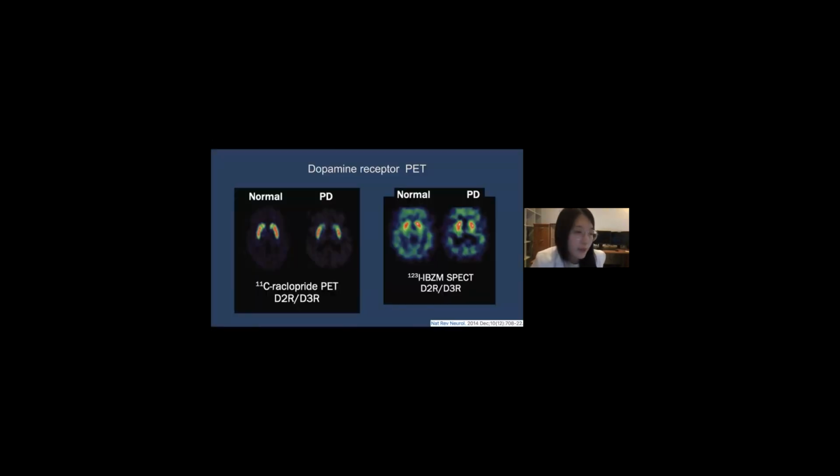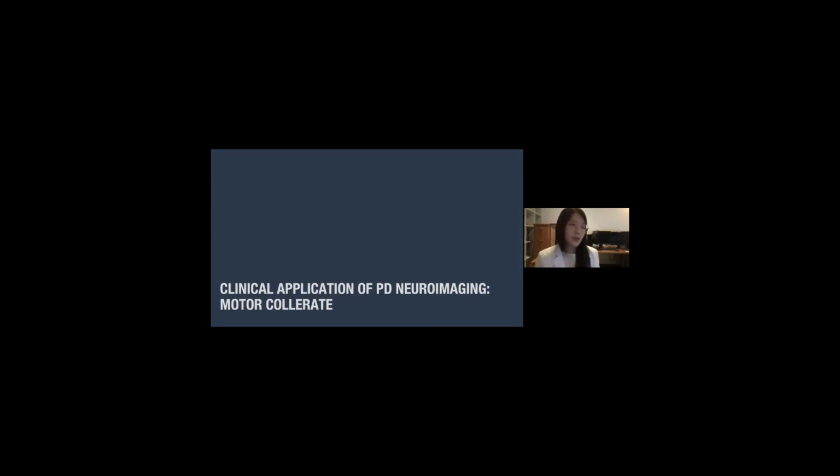And another point is preservation of postsynaptic receptor and metabolism in typical PD, which was mentioned in previous slides. Next issue is dopaminergic binding of neuroimaging. Biomarker has been reported to be correlated with the clinical severity of motor symptoms that could be targeted with novel dopaminergic treatment.